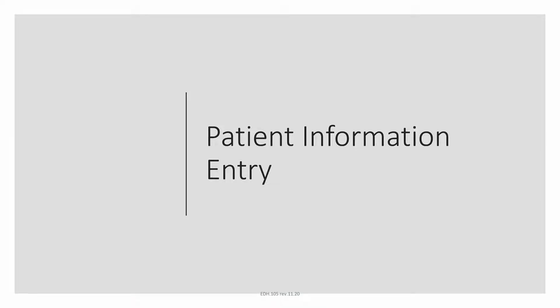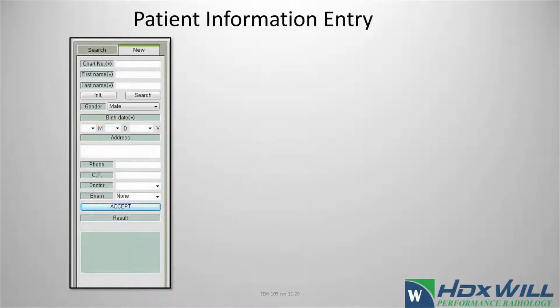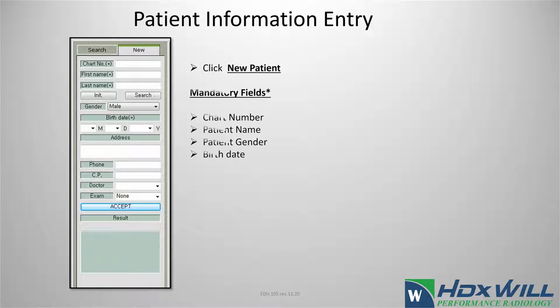Every patient who has not taken a scan will be considered a new patient, and you must enter in their information in order to take a scan. First, you must click on the New tab. You must enter in a chart number, which can be a chart number already used in your patient management software, or if you don't have a chart number, it must be something unique to that patient, like a phone number or a social security number.